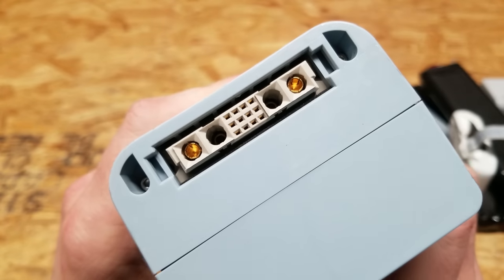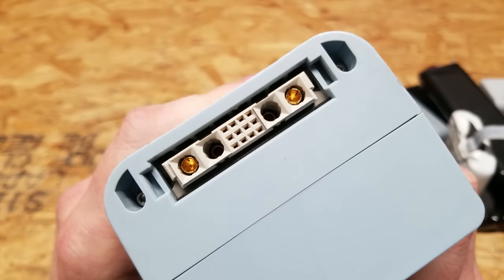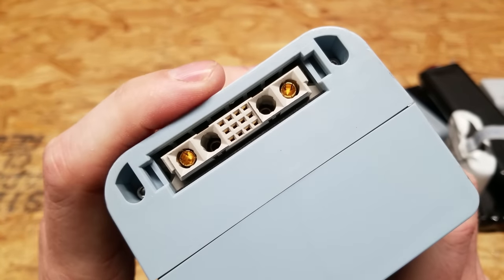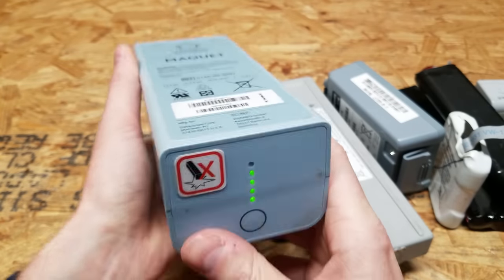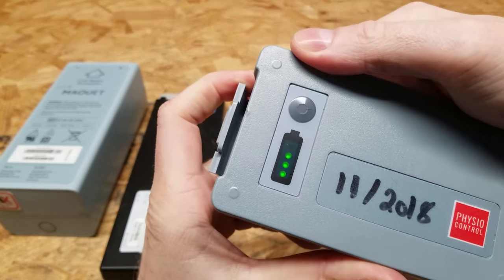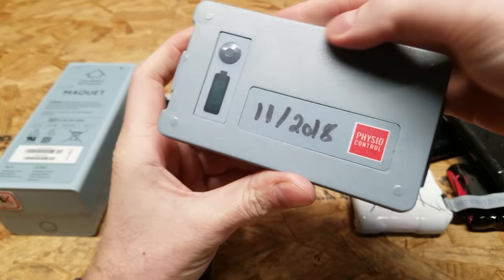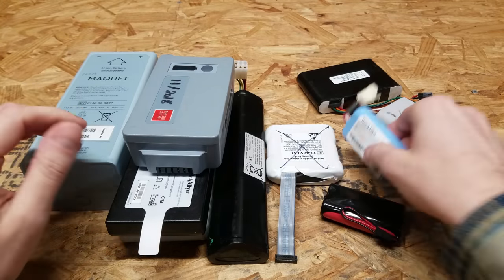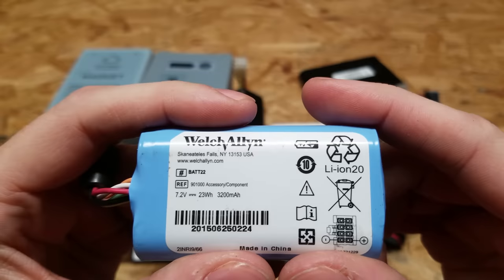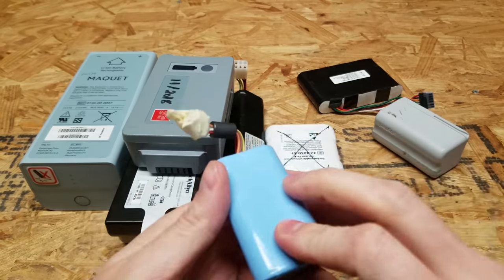This one's got an interesting connector on the end — some kind of banana plugs, and probably a communications or BMS port. That one's almost fully charged, we've got 4 out of 5 dots. That one's looking good too, 3 out of 4, and this one's dated 2018. I'm not going to open all these on camera, I'll probably do some of the larger ones, but one of the more interesting smaller ones was this one that indicated 3200 mAh cells.